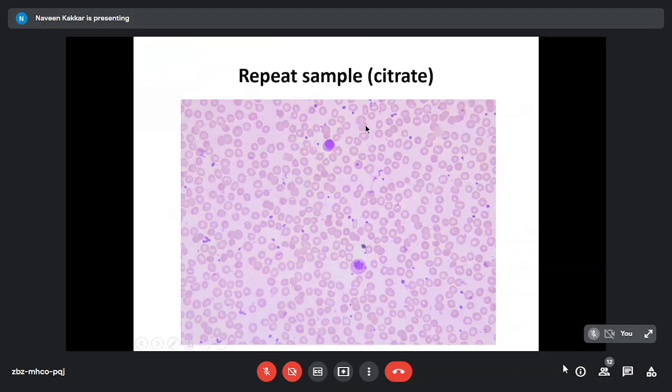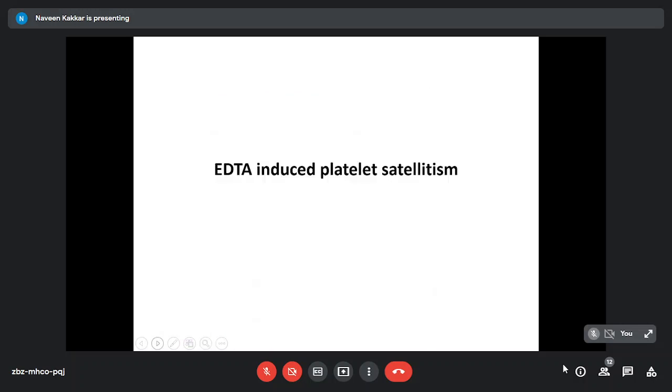That's a repeat sample in citrate. You can see there is no satellitism, no clumping. The platelets are all opened up and separate. So that's EDTA-induced platelet satellitism. Your answers are heparin and sodium citrate samples.